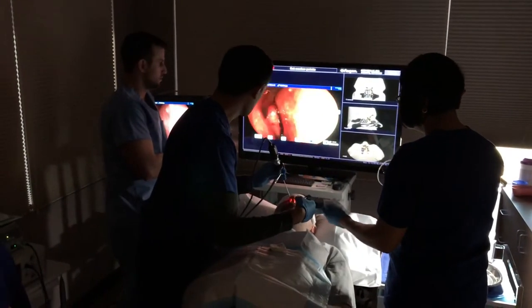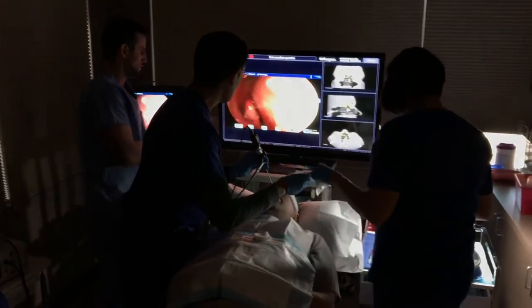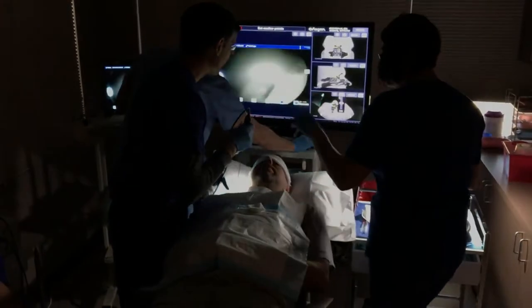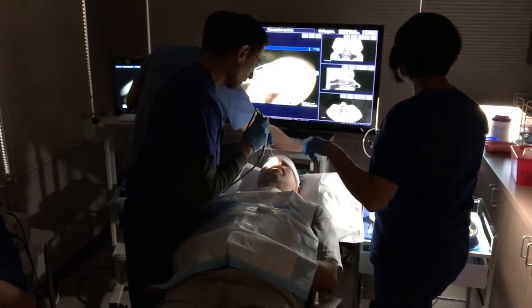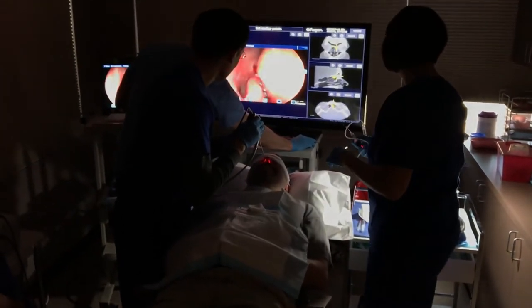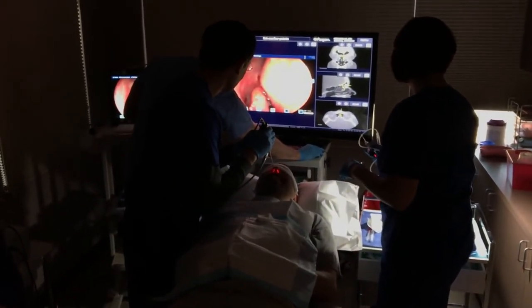Can you do me a favor? Can you scroll through the images here to the frontal sinus? How's it looking? That's all right. I could be watching NCIS.